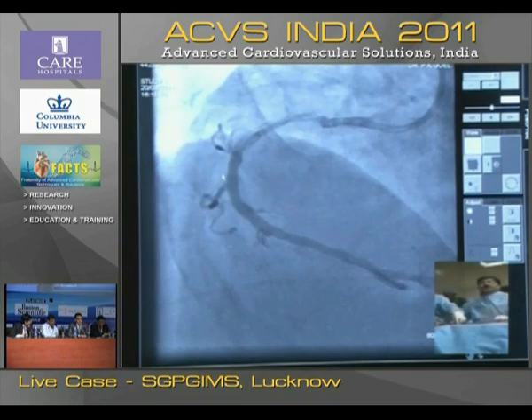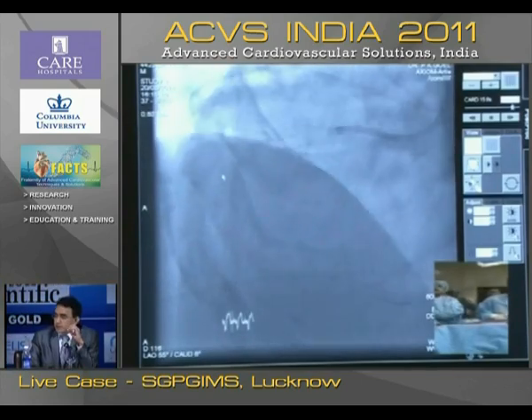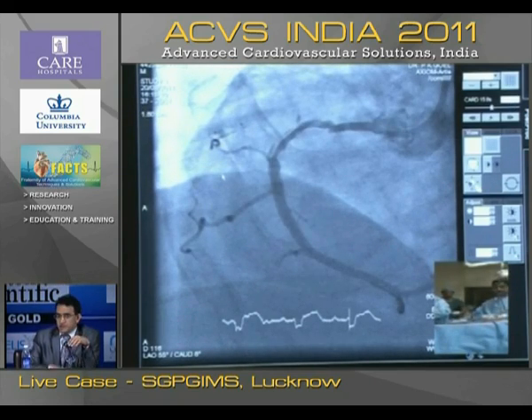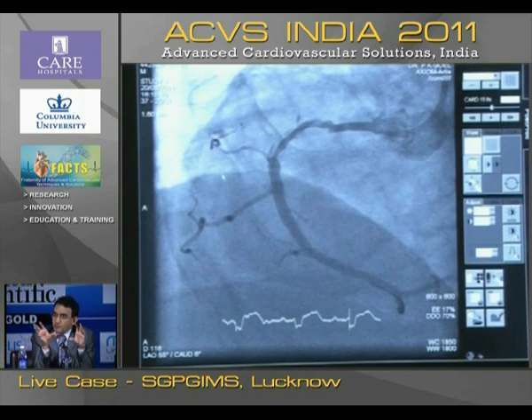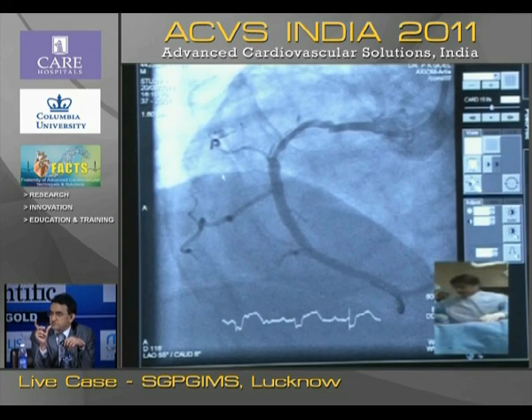The point I was trying to say is, a microcatheter, by its very virtue of having a higher profile, sometimes does not cross the entire lesion. You are correct, it may enter part of the lesion, but the real end it may not go. On the other hand, an OTW balloon with its much lower profile is more likely to go to the tip of the lesion. So in a relatively long lesion, an OTW balloon is a better choice than a microcatheter. If it is a short lesion, then a microcatheter is a good idea.